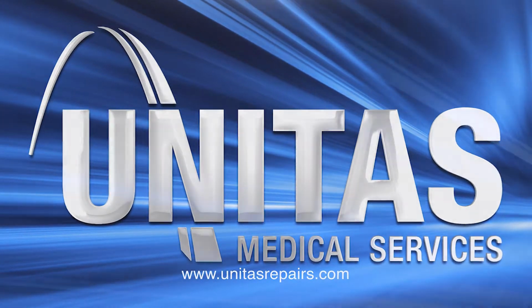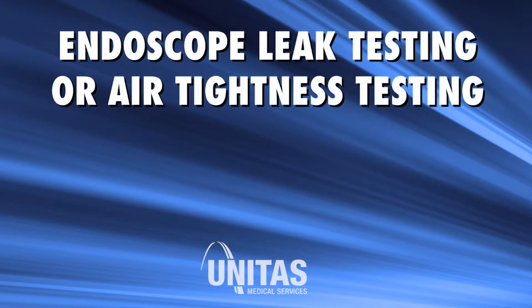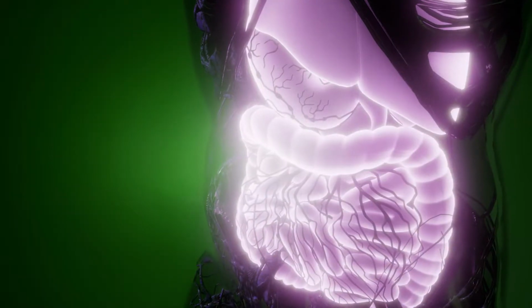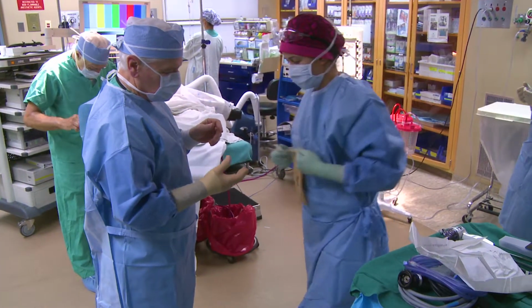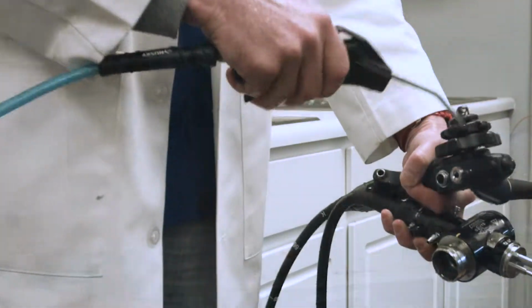I'm going to start with the most common mistakes made during flexible endoscope leak testing. Endoscope leak testing, or air tightness testing, is an integral component of effective flexible endoscope reprocessing and should be performed after each use. This is a core required step for all flexible endoscopes, regardless of manufacturer or model.